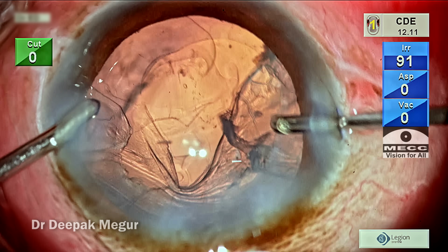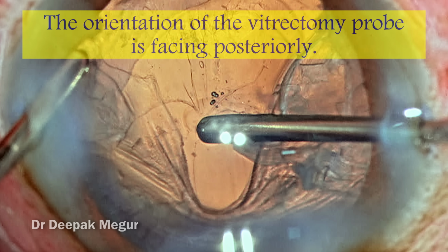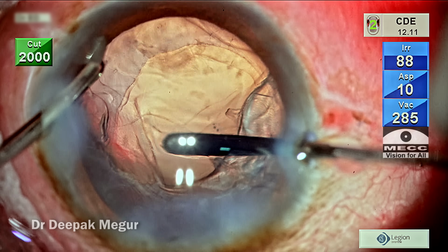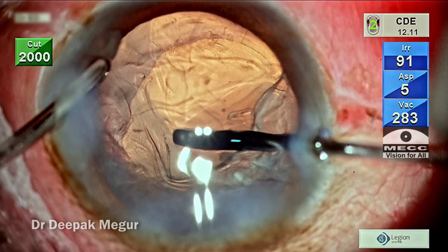Time to perform the anterior vitrectomy. Let me pause here and show you the orientation of the vitrectomy probe. I prefer to keep the probe facing posteriorly, and I begin to do the vitrectomy. The vitrector is placed at a level posterior to the posterior capsule tear.